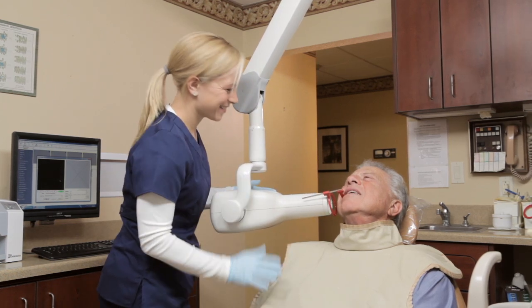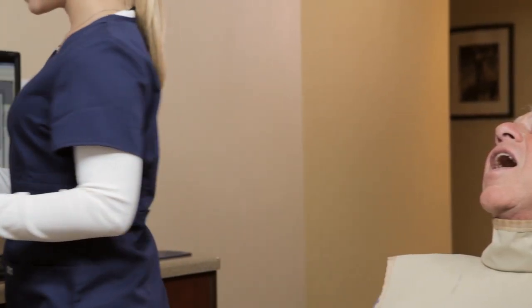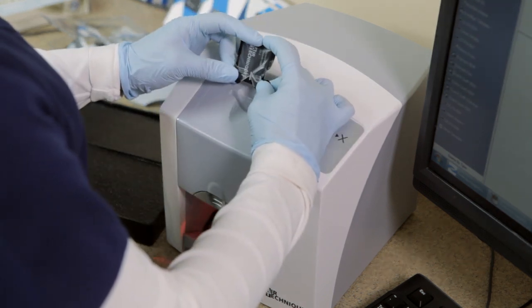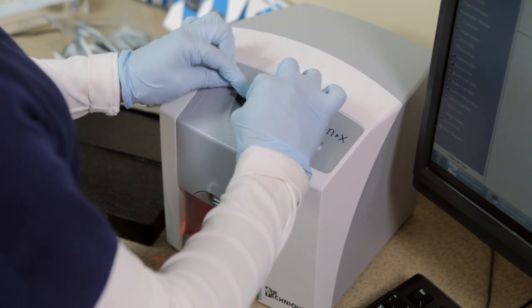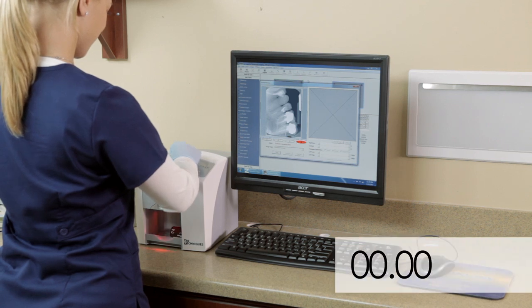Then leave briefly to go to the x-ray machine to capture the image. Remove the sensor from the patient's mouth. Hold the sensor above the inlet guide with the printed side facing you and the notch of the envelope on the bottom. Tear the envelope open, starting with the bottom notch, while lowering the sensor into the inlet guide.